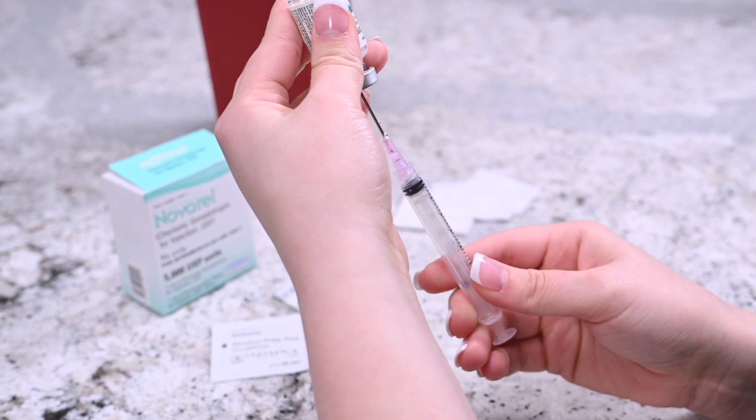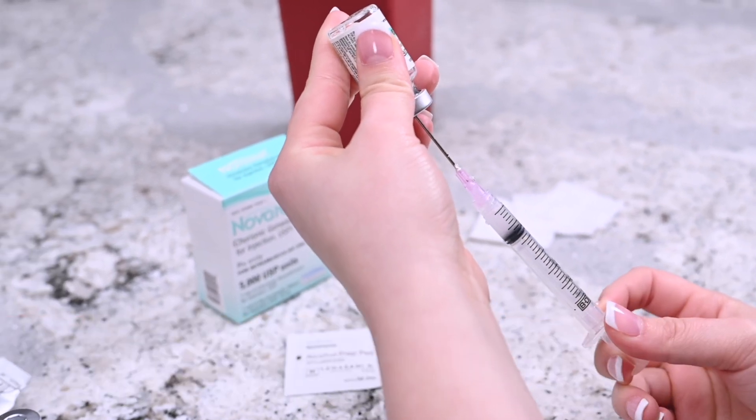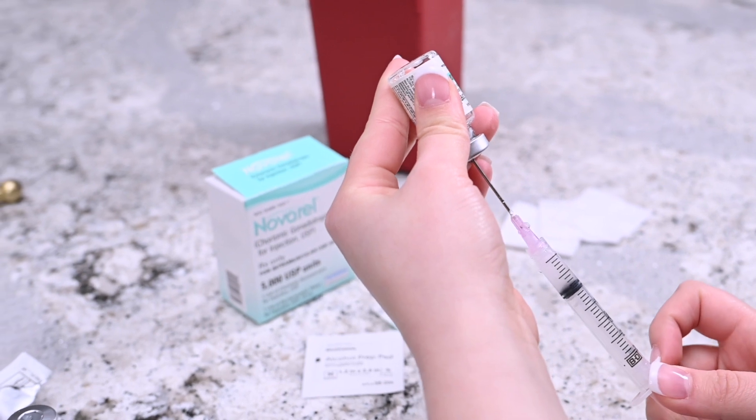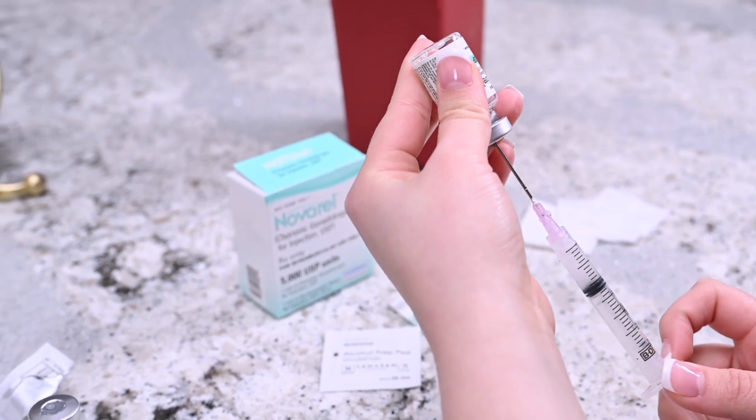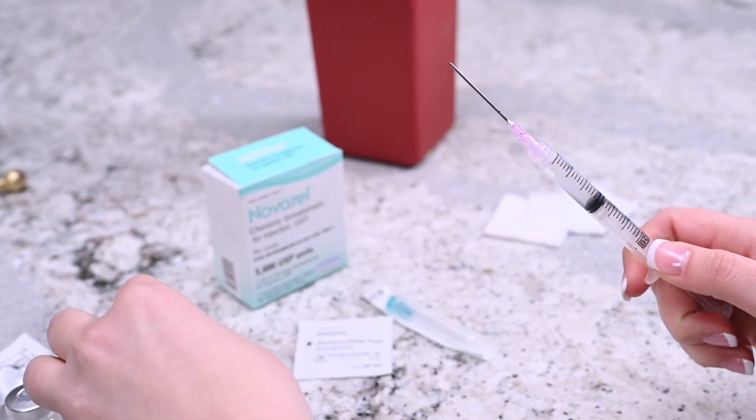Invert the syringe so that the vial is upside down but still attached to the syringe. Pull the plunger back until all the contents from the vial reside in the syringe. Remove the needle from the vial.